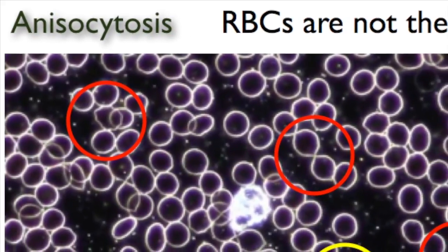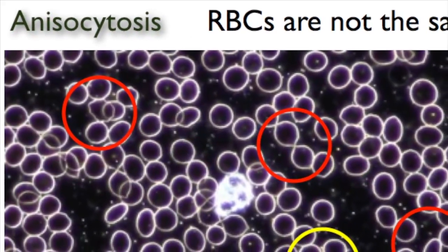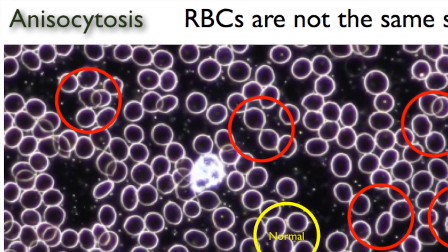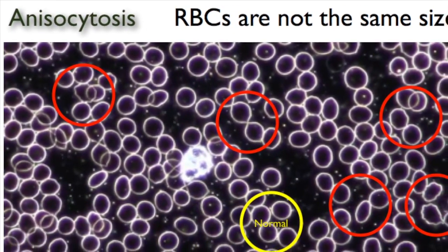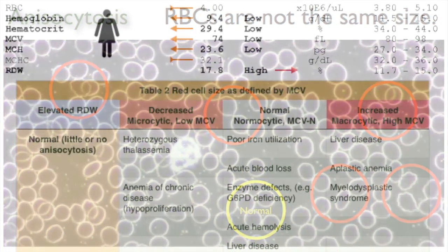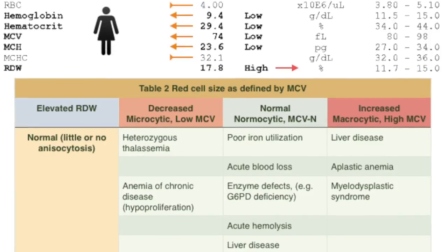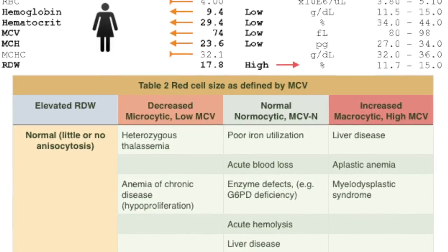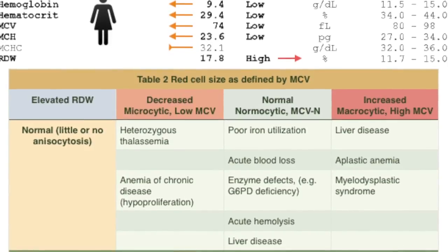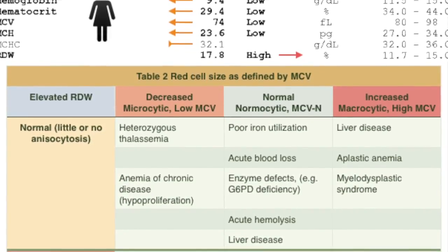Anisocytosis is a medical term meaning that a patient's red blood cells are of unequal size. This is commonly found in anemia and other blood conditions. False diagnostic flagging may be triggered by an elevated white blood cell count, agglutinated red blood cells, red blood cell fragments, giant platelets, or platelet clumps.